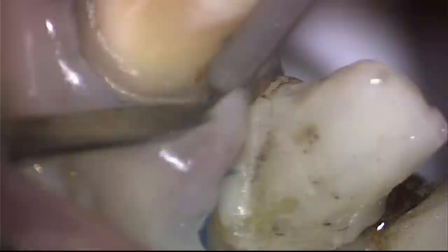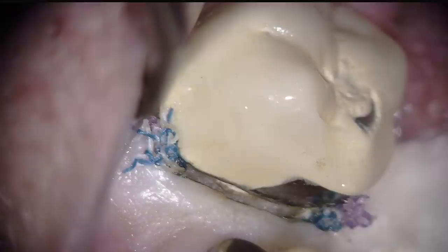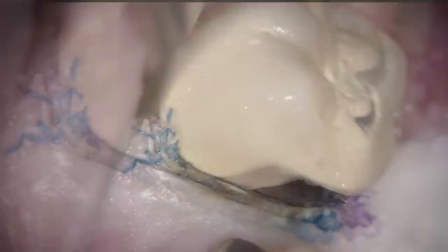To capture that in an impression, you will get a very, very wonderful fitting crown — it will feel very natural. Now if you're looking at a tooth at 2.5x, it's nowhere near this size and you would never notice this crack running deep inside the tooth. This tooth obviously has more needs than just a simple filling. This tooth had its neighbor extracted and an implant placed by a periodontist using loops. The periodontist never saw the decay and the fracture reaching underneath this crown — the periodontist did not have enough magnification.